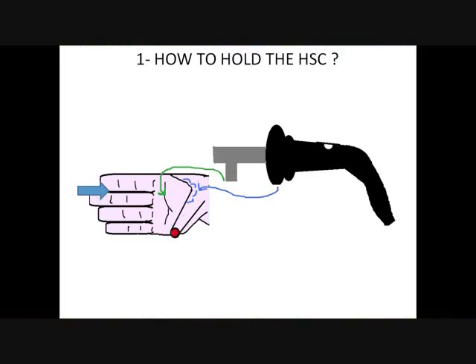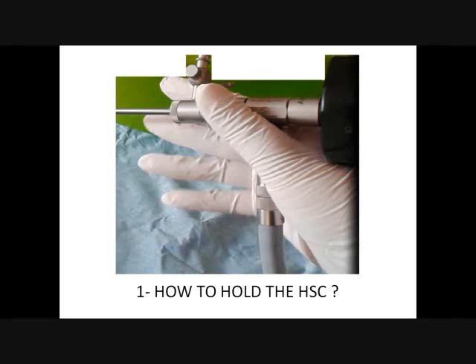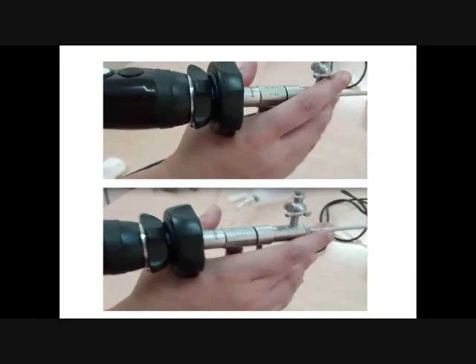And then between the index and middle finger. Just like here, or here, as you might see on the picture. And we feel really comfortable when we hold it this way. We don't feel anything on our wrist. We can move. It's really interesting.